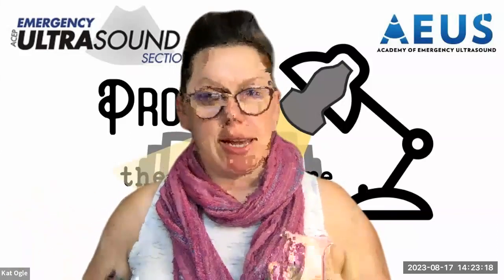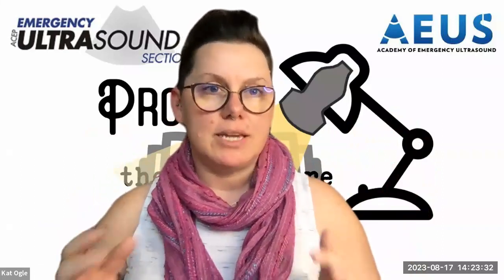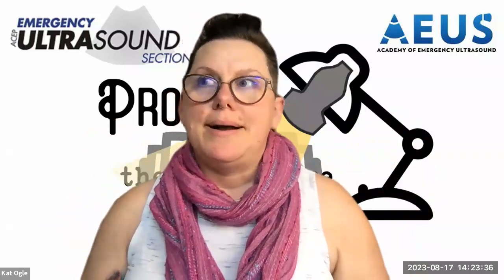On the one hand, is that annoying and frustrating? For those of you who are in your fellowships now and are stepping into this administrative role, yes, that's challenging. But if you are looking at this from a patient safety standpoint, you need to be looking at those images and make sure that those things are documented accordingly. So that would be the systems change that we made.